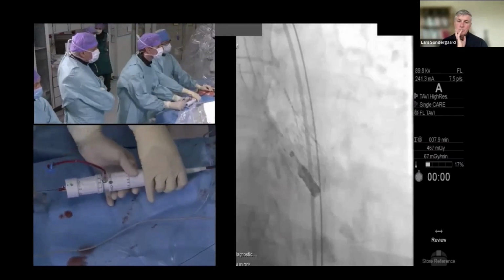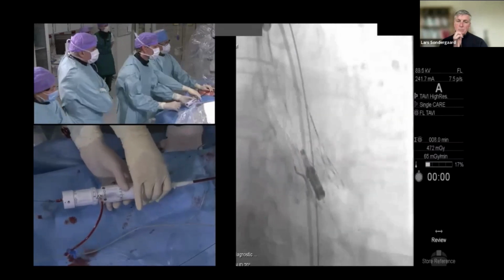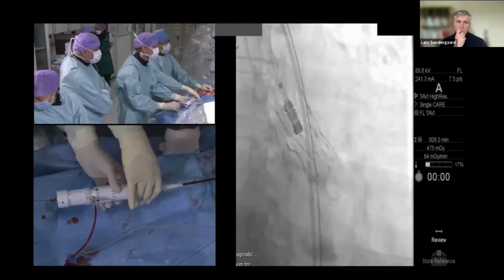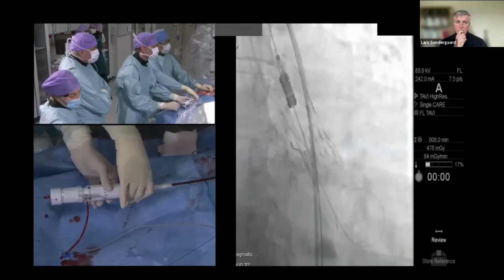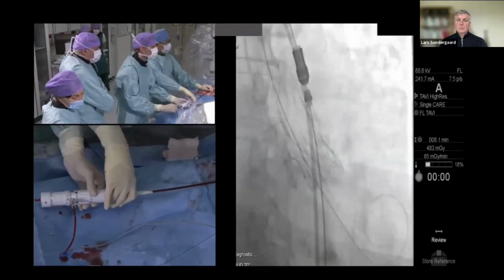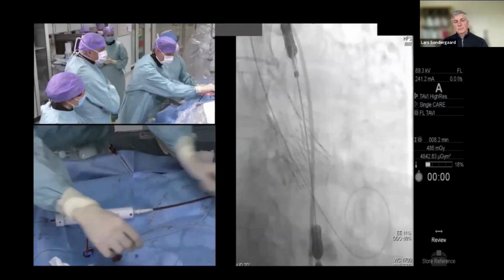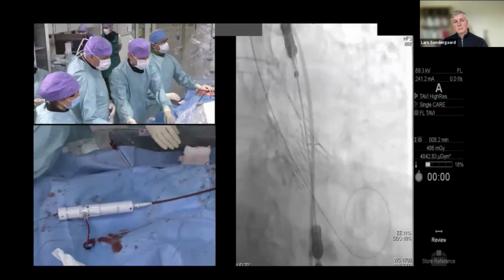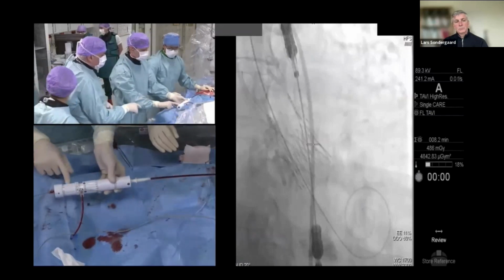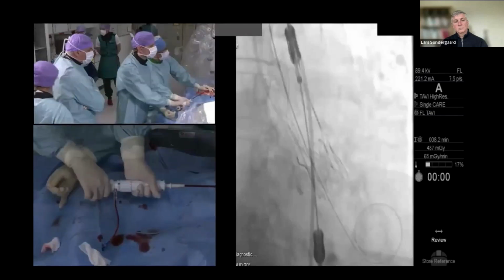Oh, careful. It was difficult to get the wire. Yeah. It appeared to be detached from the stent into the ventricular end, and it seems to be coming out nicely without major resistance, which is also suggestive of a nice release from the system. So all good, all stable. We're happy there. And there's no need for pacing here, so we can detach the crocodile and you do the closure wheel. That's exactly opposite. Wheel number 2 now is going clockwise, and then wheel number 1.